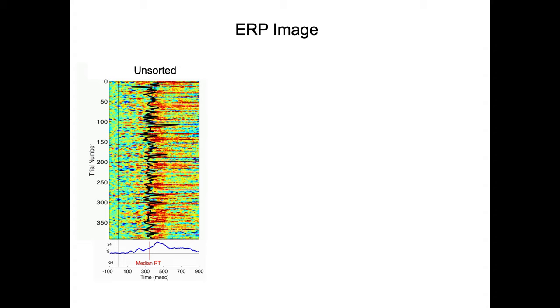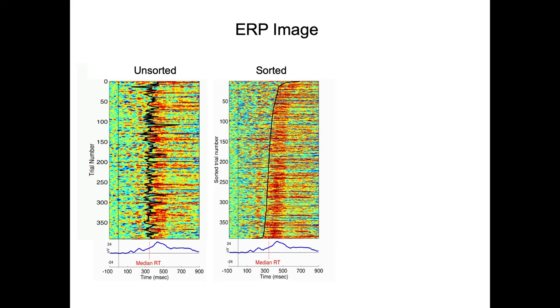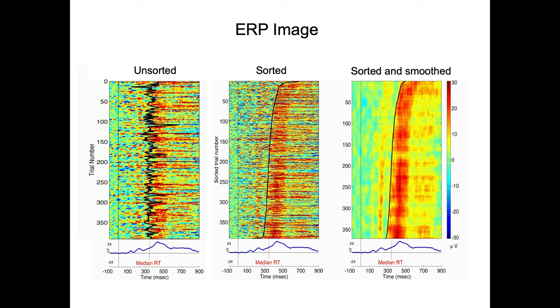Now what we can do is we can sort the trials by the reaction time of the subject and that's what's represented here. What we can do also to see better the evoked activity is that we can smooth the trials across the y dimension and that's what's represented here. Then we can see patterns emerging and in all cases you see in the bottom of each plot the event-related potential is exactly the same, we just reordered the trials. But we can see much more information in the sorted and smoothed ERP image than we can see in the ERP.